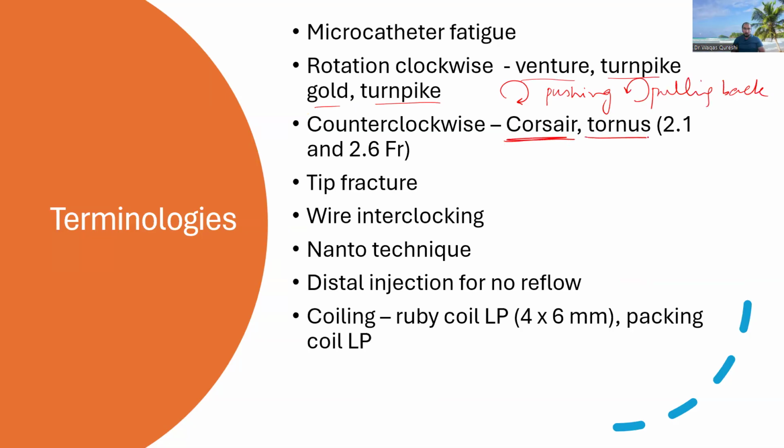Corsair, Tornus are counterclockwise while pushing forward, and pulling back, they're clockwise. Okay. Pull.